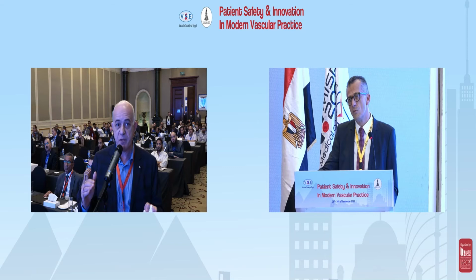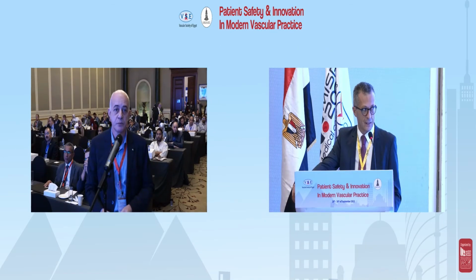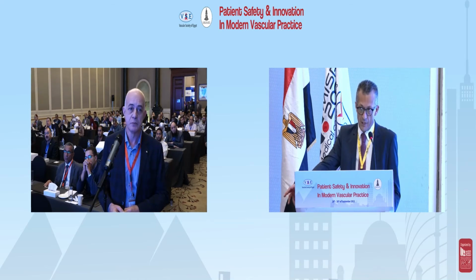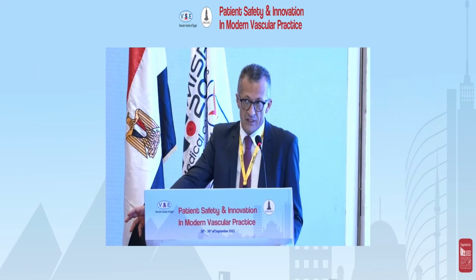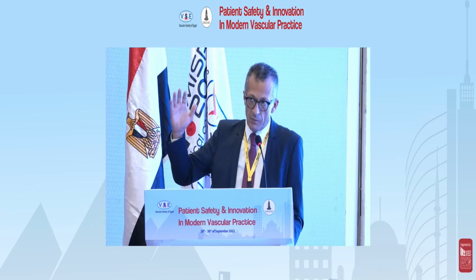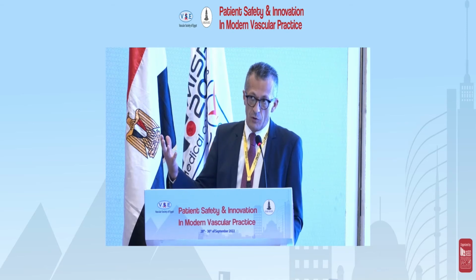If you want to pave the way for your Rotarex to go upwards, pre-dilatation, and you can use the flow in an antegrade manner. Yes. Okay. Could it be possible or not? Yes. I avoid predilatation in this patient because usually it's a fragmentable material, and then there is a risk of embolization. I try to go in retrograde without blood flow to remove all fragmentable material.